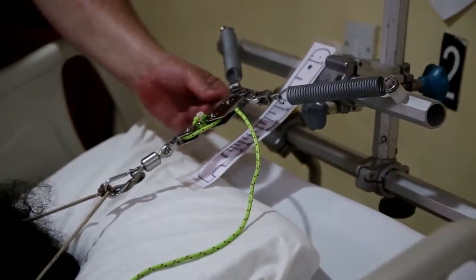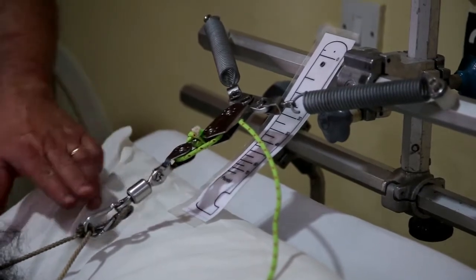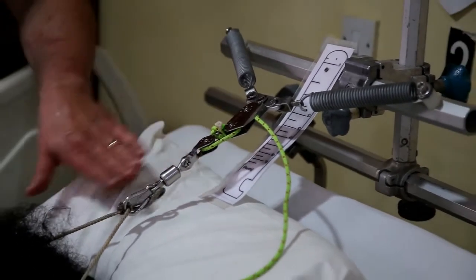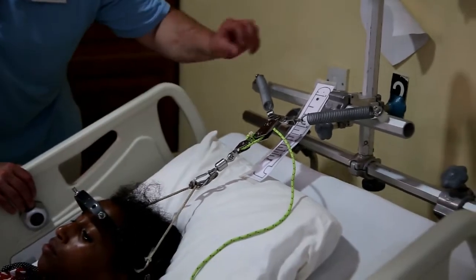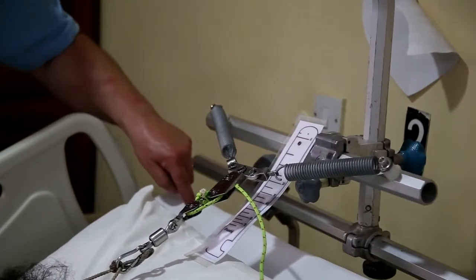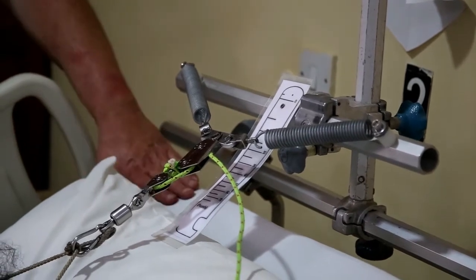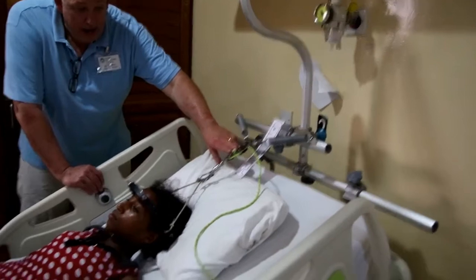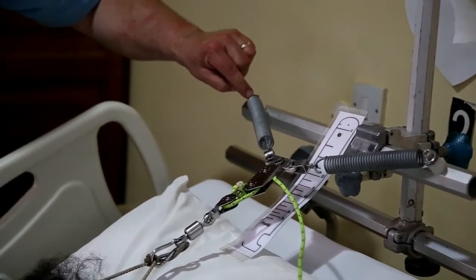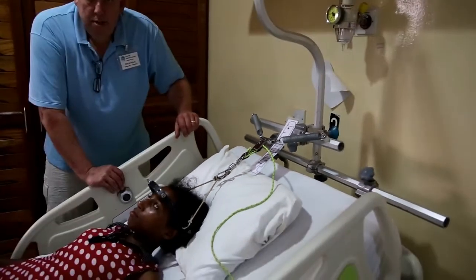The main thing to ensure when the patient is lying down is that the pull of the traction line is parallel to the inclined bed — not resting on the pillow or bed surface. The traction unit also needs to be rotated so that the pins where the springs are mounted are perpendicular to the bed, so the springs don't pop off the carriage. Three things to remember: incline the bed 30 to 45 degrees, use half the traction amount, and ensure the traction pull is parallel to the bed with the spring pins perpendicular to the bed surface.